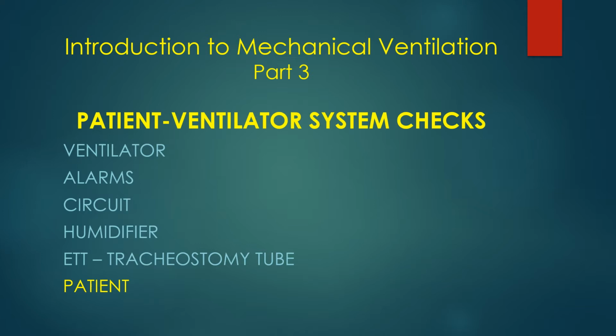The ventilator check, the part on the ventilator, we want to make sure the ventilator is set according to doctor's orders, and we want to make sure that the patient is tolerating these settings on the ventilator that we've chosen, that is to ventilate the patient. So let's continue on here.